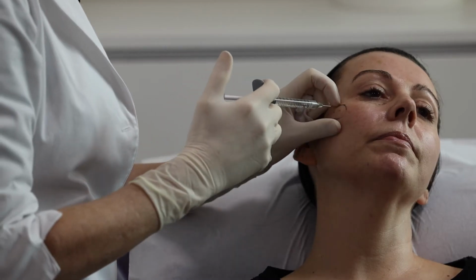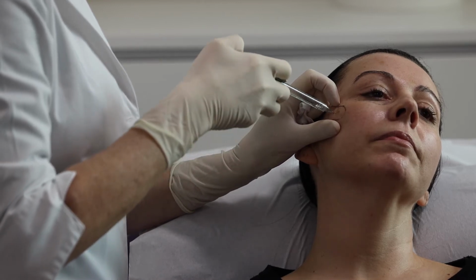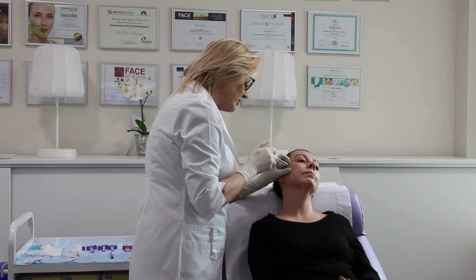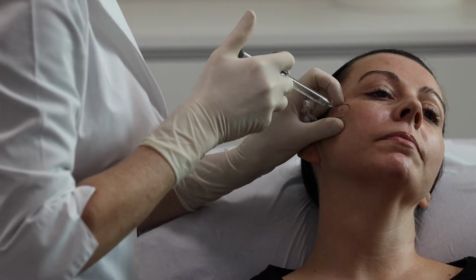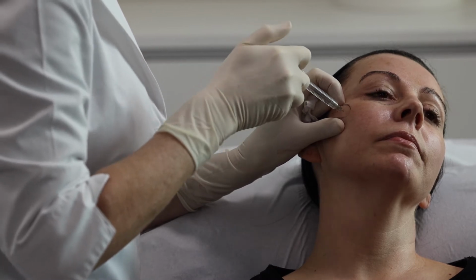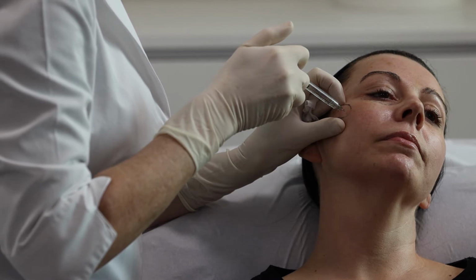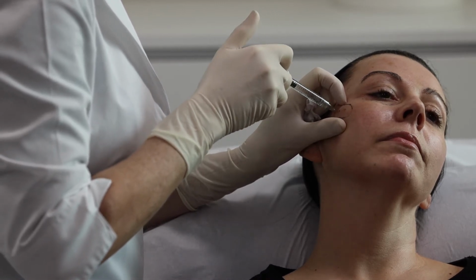So I'm going to be lifting, and I'll be injecting first in CK1. I'll aspirate on bone, and I'll deposit 0.1, just a small aliquot on the bone, second little pinch, and I'll aspirate, and a second 0.1, and then I'll be doing a third 0.1.